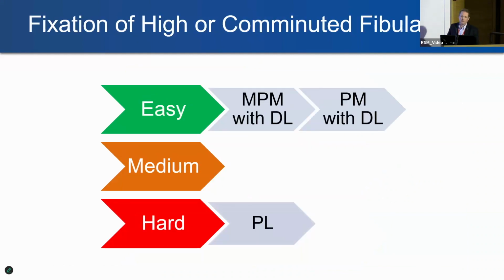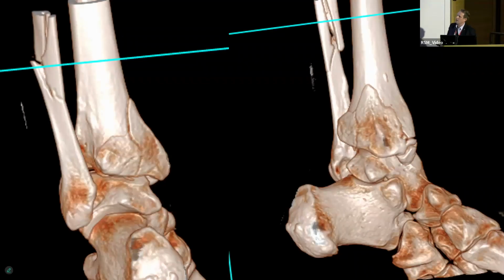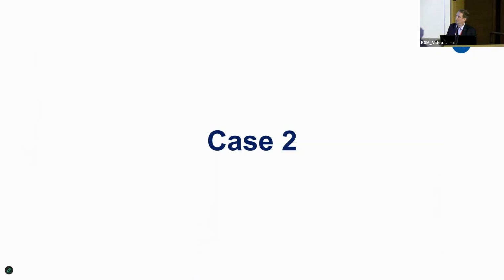Fixation of a high comminuted fibula. Jane argued with this last year, said it's very easy to fix the proximal fibulas through the posterolateral approach. I highly disagree with that, having done many over the years. As you can see, it was on my algorithm. It was always a sweaty venture. So in a case like this, we've got a high fibula coming up, doing a very long posterolateral incision here, and taking out your peroneal artery and its perforators, and then trying to balance on a plate on top of this is very difficult, but doing it through the direct lateral is very easy.